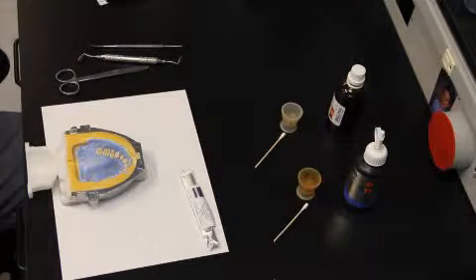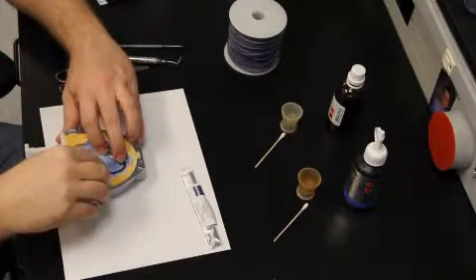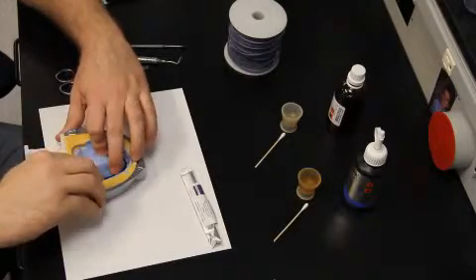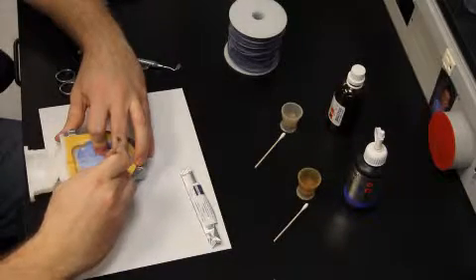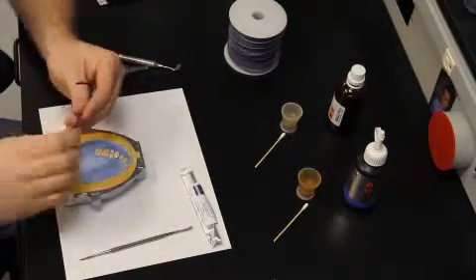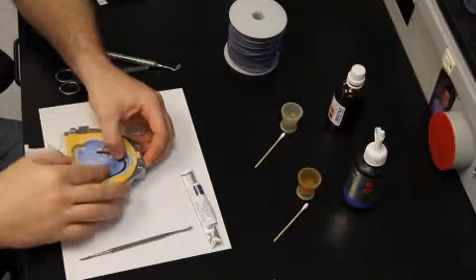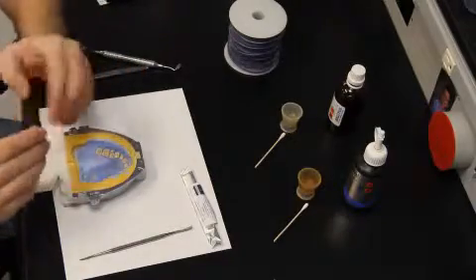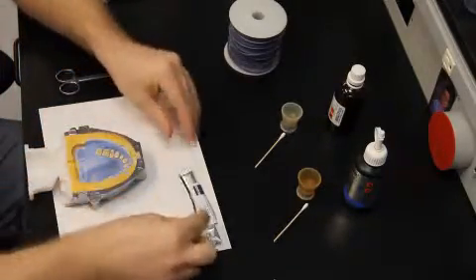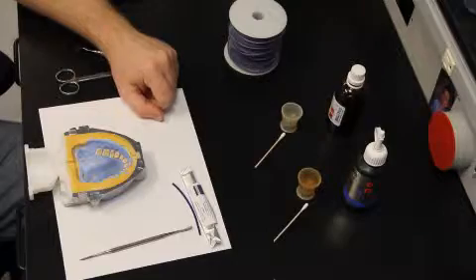First thing I do is I take a piece of rope wax, chunk it out, and it just helps me with my length. So I'm going to stick it on the teeth and get my length. I'll take my number 7, score it, break it off, verify it, see if that's the length that I like, and it is. So from there, I'm going to straighten it out and put that aside.